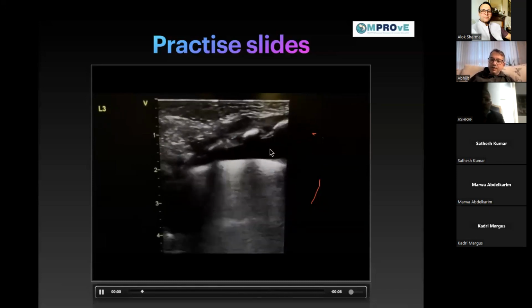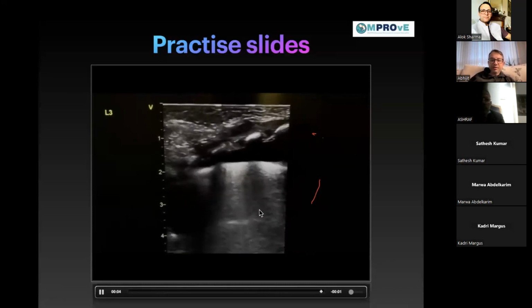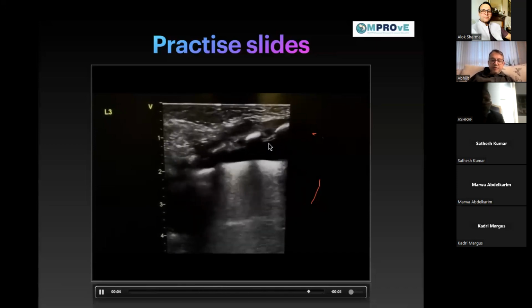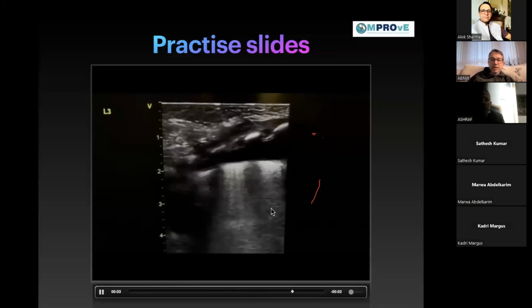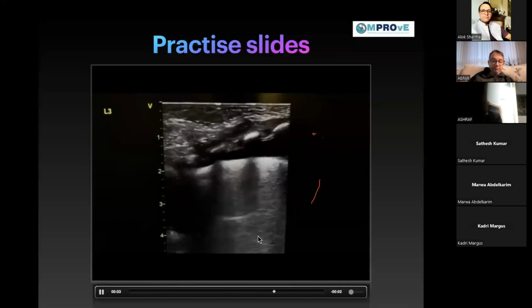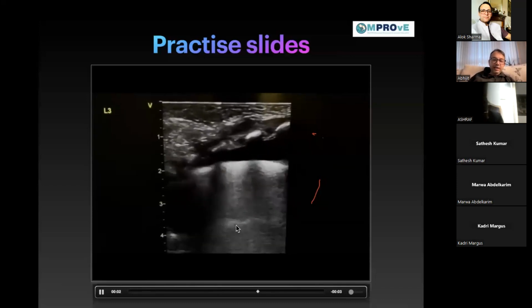But now you need to focus, because the pleural effusion will help your ultrasound waves to traverse all throughout the lung. So you're going to shift your focus of the lung ultrasound from this part of the zone to this part and concentrate here to find out, is there a collapse, is there a consolidation, or am I dealing with the normal lung here?